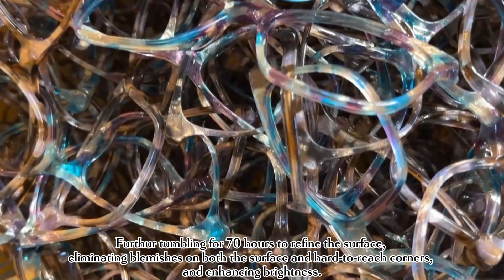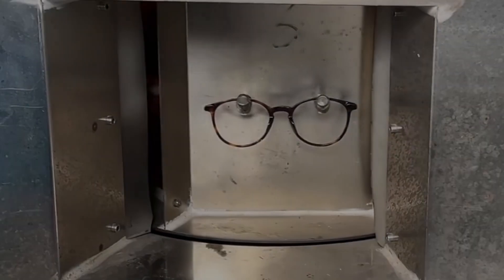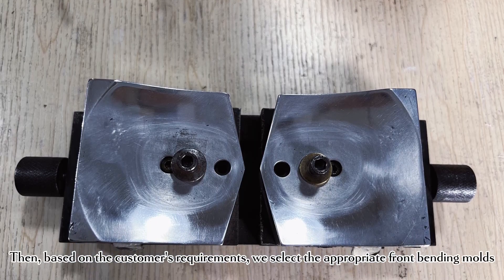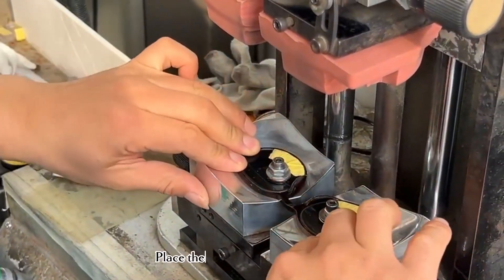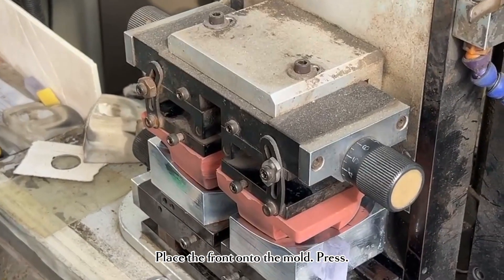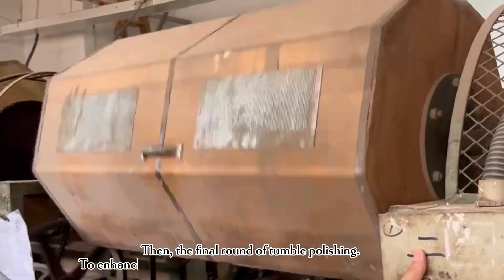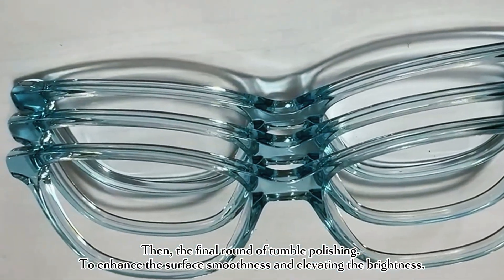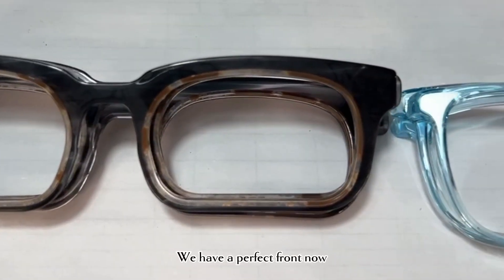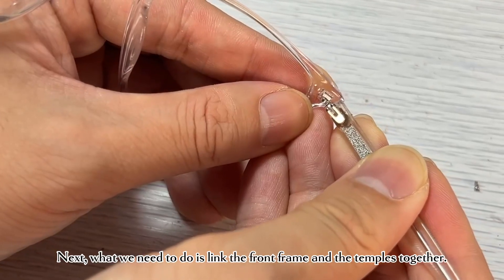After that, we need to bend the front. Heat softens the frame, then based on the customer's requirements we select the appropriate front bending molds, place the front onto the mold, press and cool it. Then a final round of tumble polishing enhances the surface smoothness and elevates the brightness. We now have a perfect front.